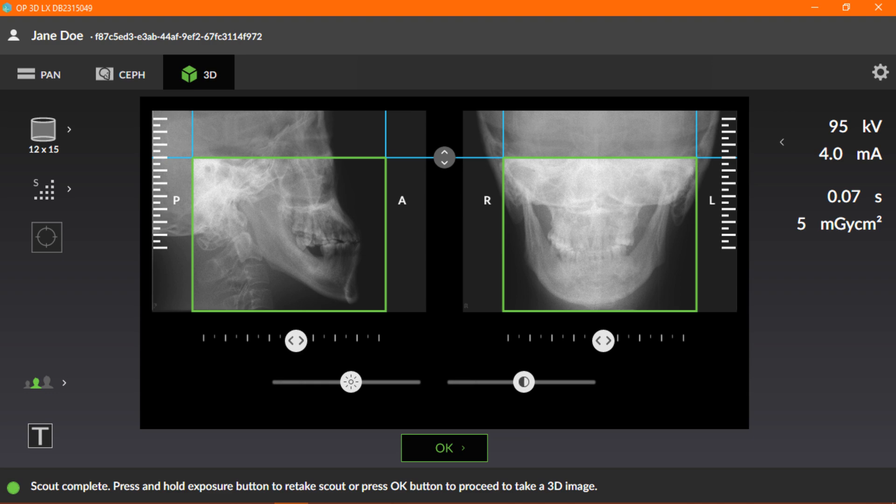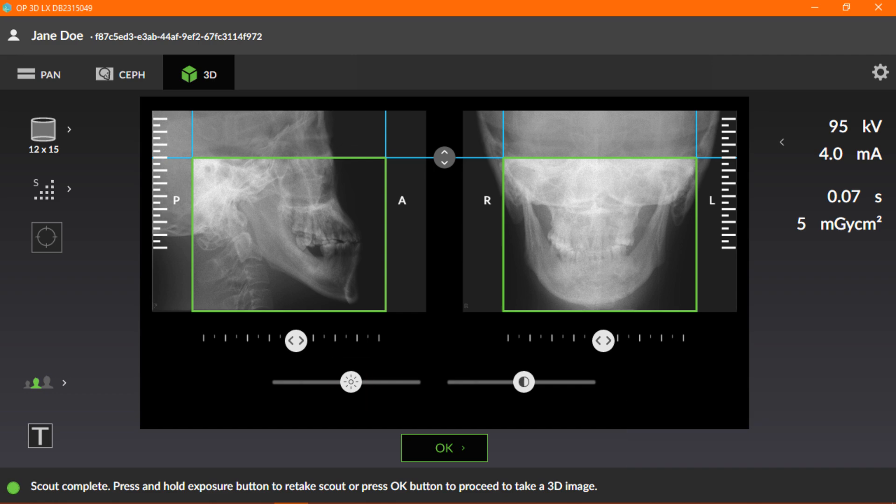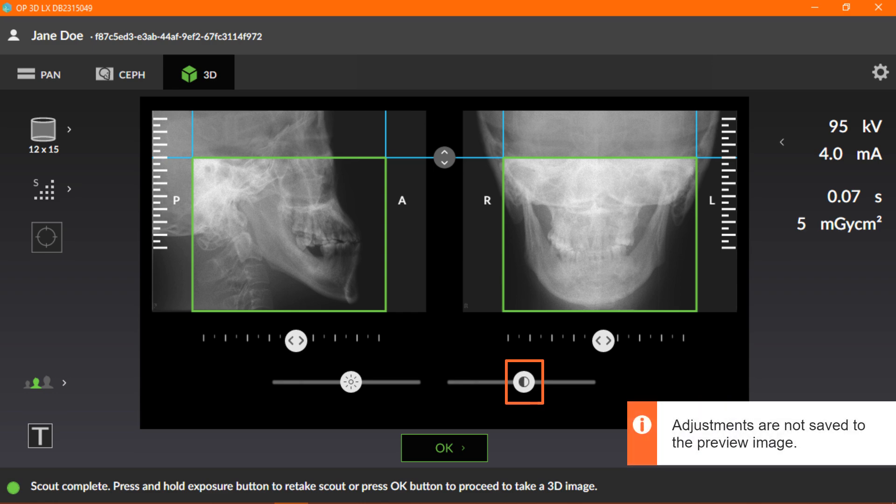You can adjust the brightness of the image using the brightness slider. Please note that adjustments are not saved to the preview image. You can adjust the contrast of the image preview using the contrast slider. Again, adjustments are not saved to the preview image.